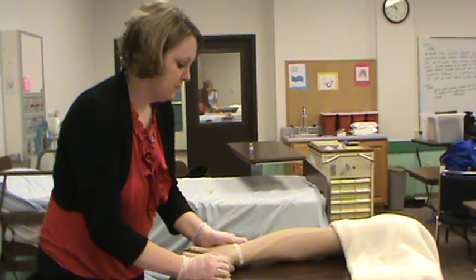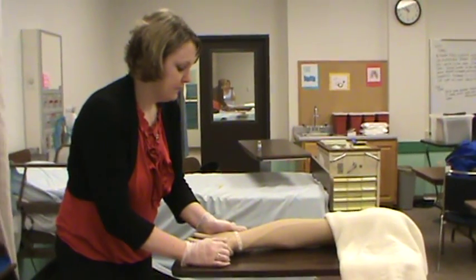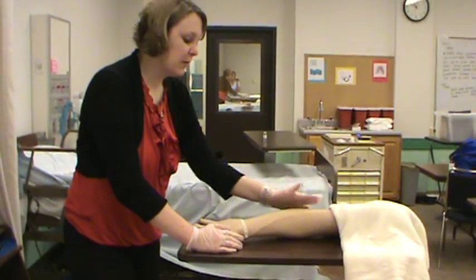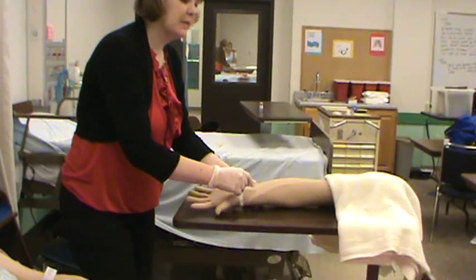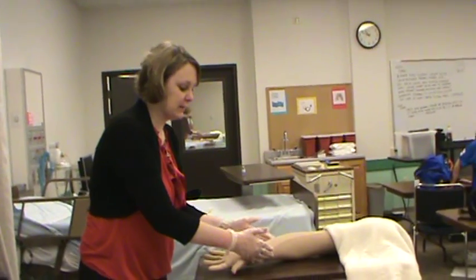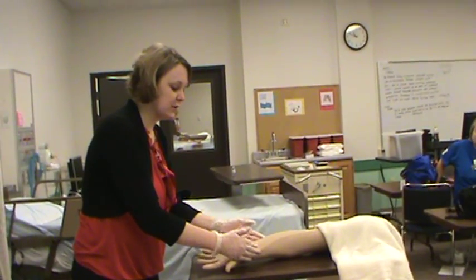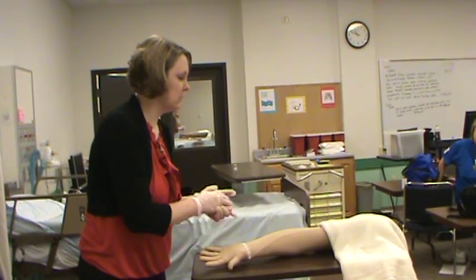Observe for signs of an allergic reaction. Okay. Leave client safe and comfortable. So I would make sure that they were left safe and comfortable. One thing I would like to note is in the hospital setting, you'll want to trace around this so that we actually know where we're to be looking, because it's likely that the nurse that administered the TB test won't be the nurse to read it. We want to know where exactly to look.